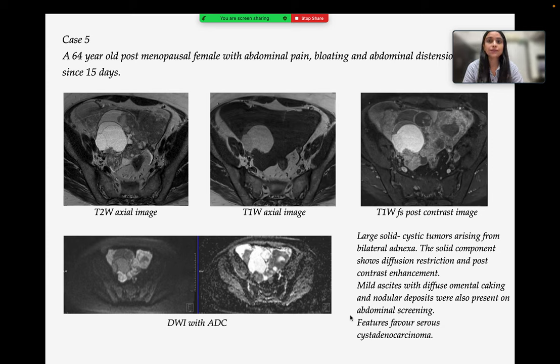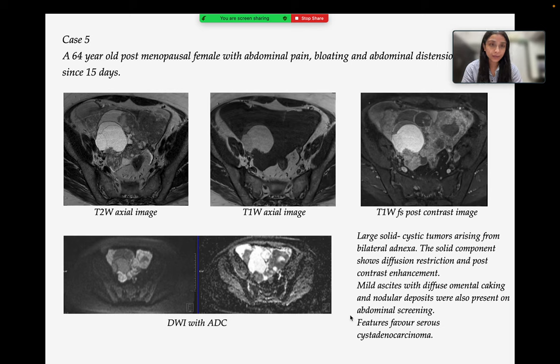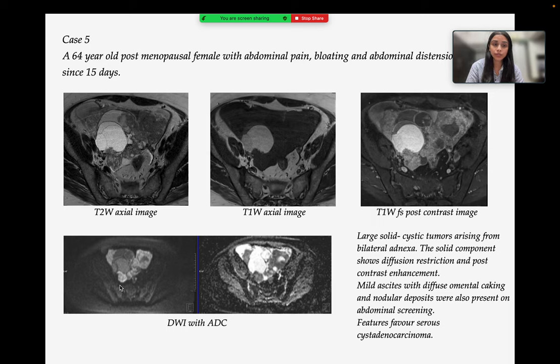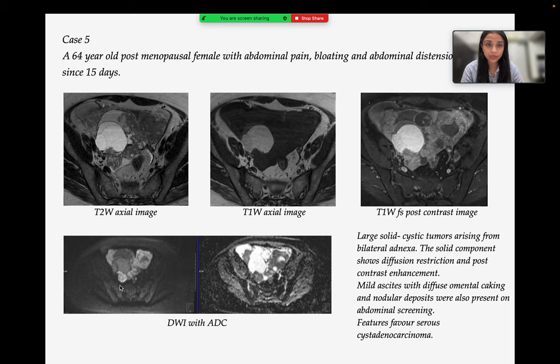Case 5 is a 64-year-old post-menopausal female with abdominal pain, bloating, and abdominal distension since 15 days. Large solid cystic tumors arising from bilateral adnexa are seen. The solid component shows diffusion restriction and post-contrast enhancement. Mild ascites with diffuse omental caking and nodular deposits were also present on abdominal screening, and features favor serous cyst adenocarcinoma.